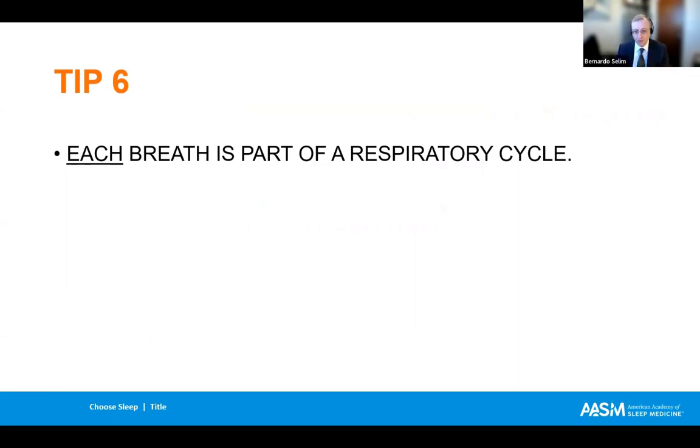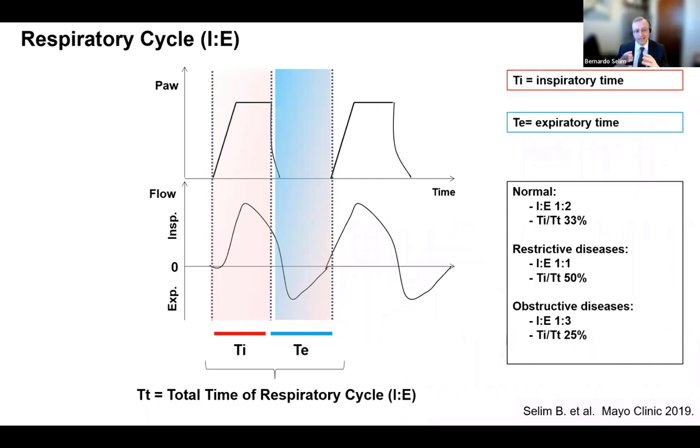You need to understand also that there is a bigger picture before you start managing these settings that you need to be aware of. And this bigger picture is that every time that you breathe in, you need to understand that there is a timing that you need to breathe out. And both of them compose what we call the total time of the respiratory cycle.